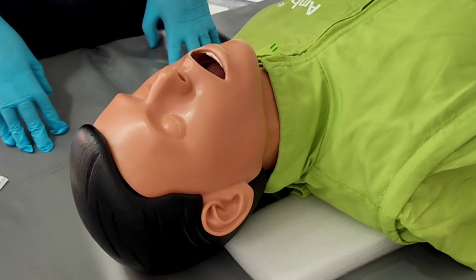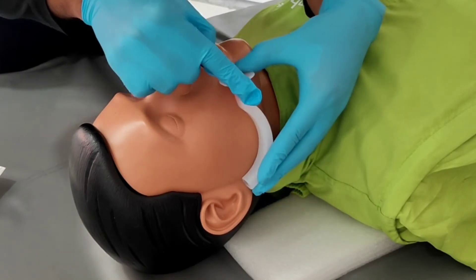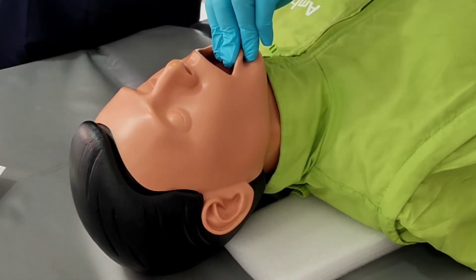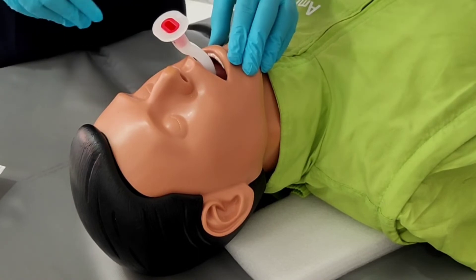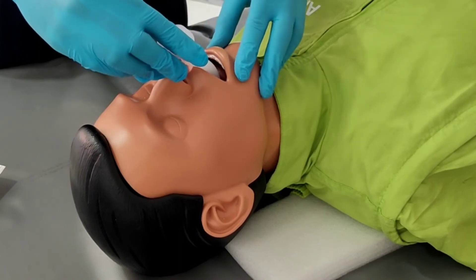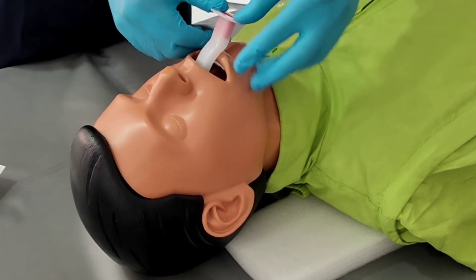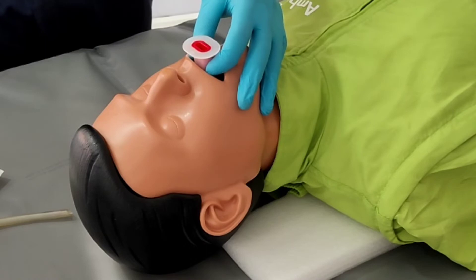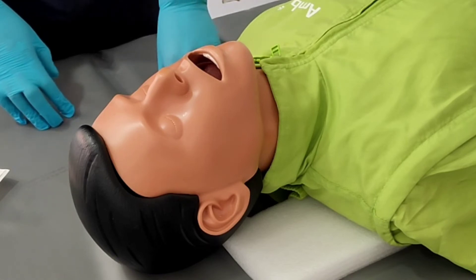Now let's see how to insert an oral airway. First, measure the oral airway to find the appropriate size — measure the distance from the patient's earlobe to the corner of the mouth. Open the patient's mouth with the cross-finger technique or tongue-jaw lift. Hold the airway upside down, insert it with the tip facing the roof of the mouth, and slide it until it touches the roof. Rotate the airway 180 degrees after it passes through the soft palate. Insert the airway until the flange rests on the patient's lips and teeth — in this position, the airway will hold the tongue forward.